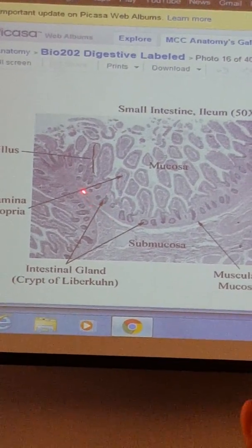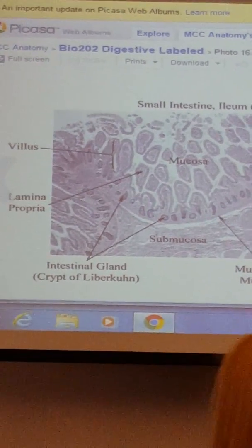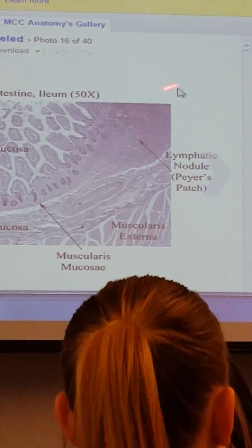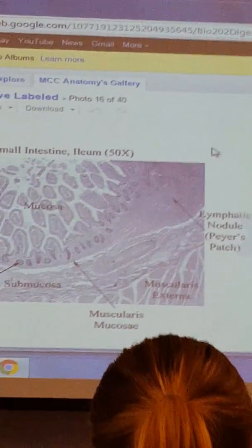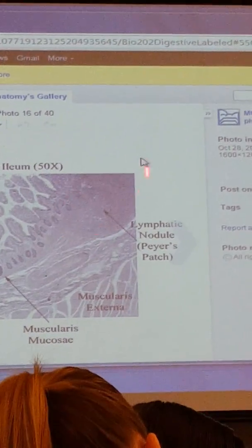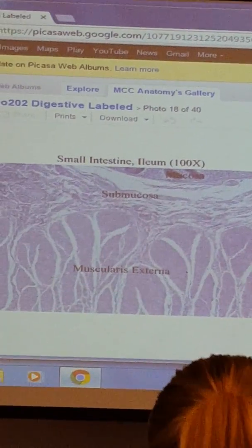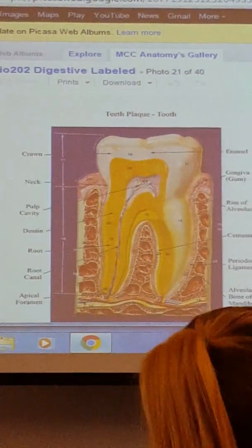The dark intestinal glands, the pink line would be right there at the bottom. And this doesn't have duodenal glands underneath that pink line because this isn't the duodenum. But it's got this big, dark, purpley Easter egg looking shaped structure. That's a Peyer's patch. This is the ileum. Not the greatest picture because you can't see the color, but usually you can see the color real well. Okay, the villi, finger-like structures. Okay, that's about it, I think, on this one.